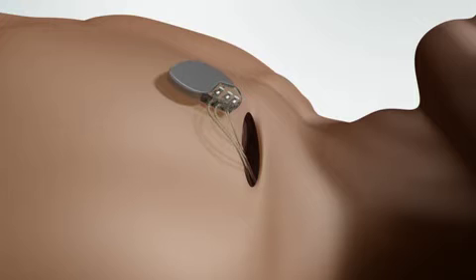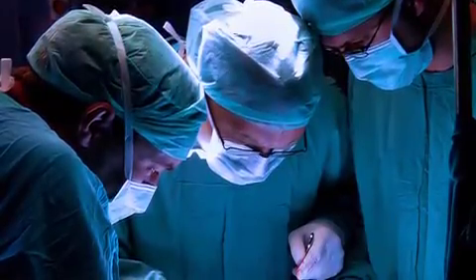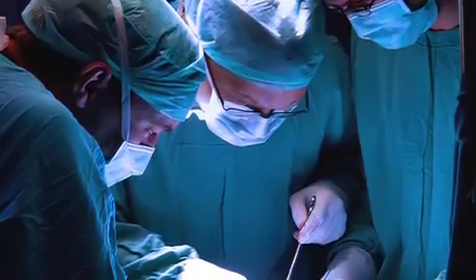The pulse generator is connected to the leads and placed in the pocket. The incision is closed. The length of the surgery depends on what kind of device you are getting, as well as your specific anatomy and the time it takes to position the lead.